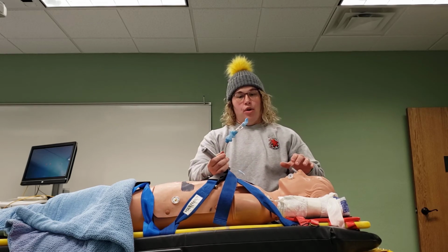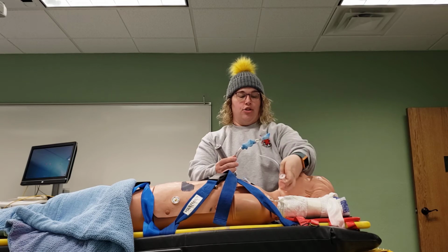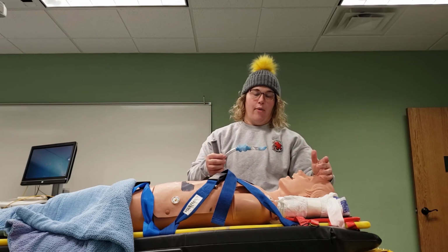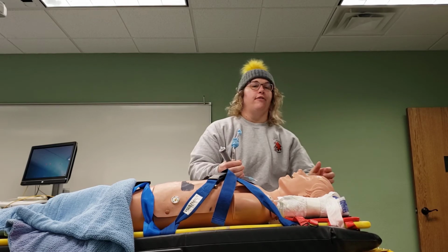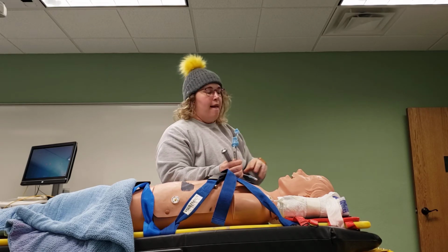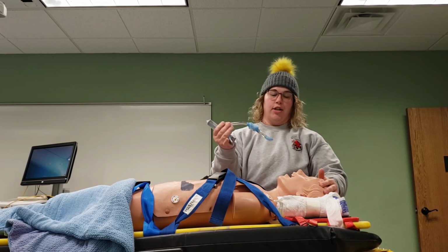So when you do put any airway device in, remove those adjunct airways. Even those NPAs, if you've gotten a really large size and shoved it down there, can get in the way. These two might be rubbing together and it might obscure your ability to push it in. So clear the airway. Again, head tilt, chin lift. You want to put them in a sniffing position, which is their head slightly back and nose to the sky. It's kind of like the snob position of their head. So hyperextending that. And then blind insertion airways are super easy because you just stick them until you meet resistance.